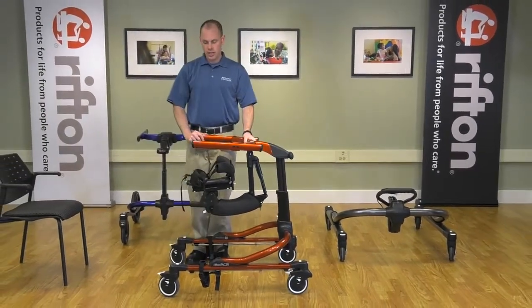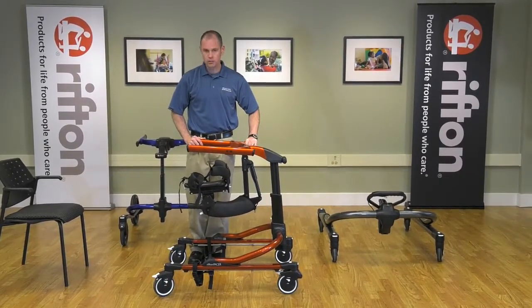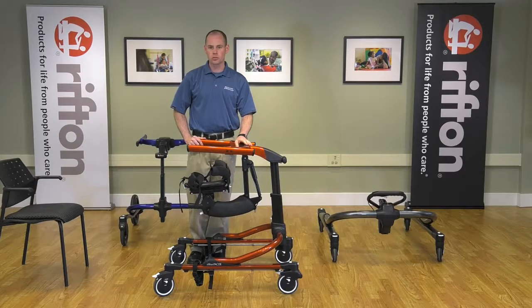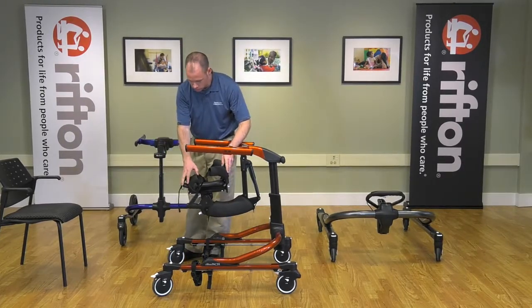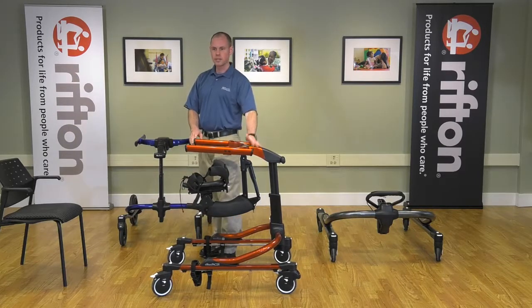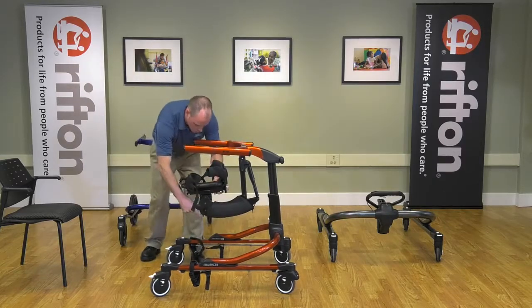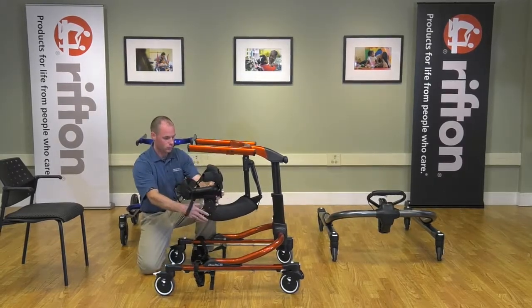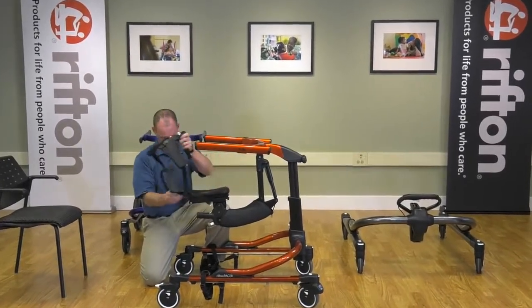The one other thing you can still do is allow for reverse ambulation. Having the client and the pacer walking with the pacer supporting them from behind. To do that, what you'd need to do is take off the hip corral.